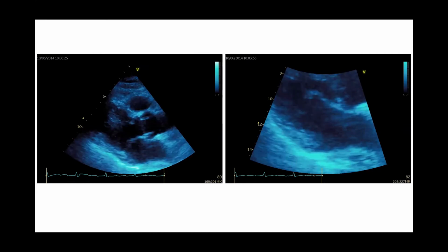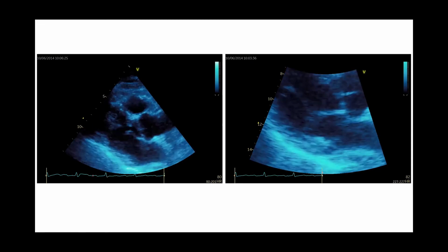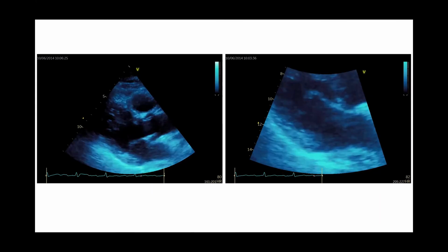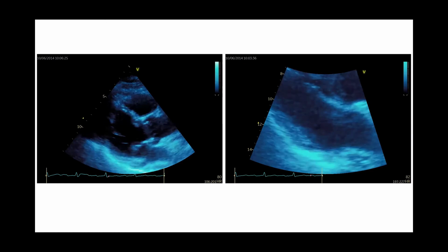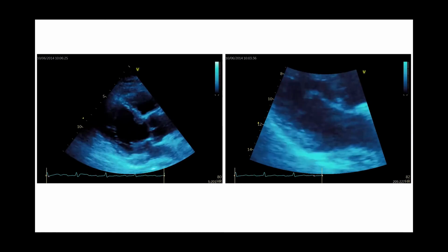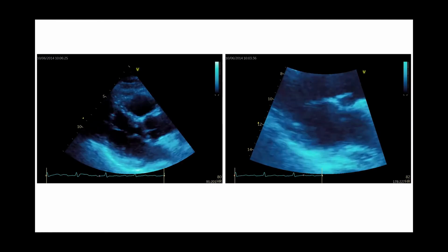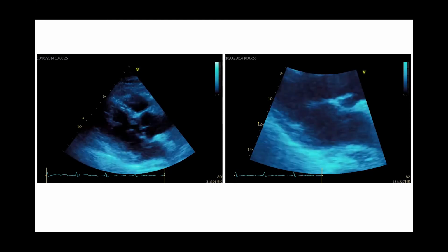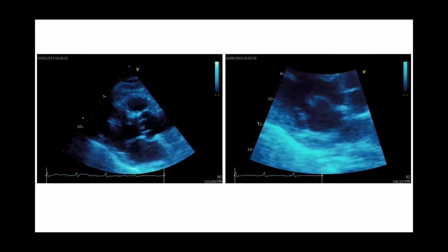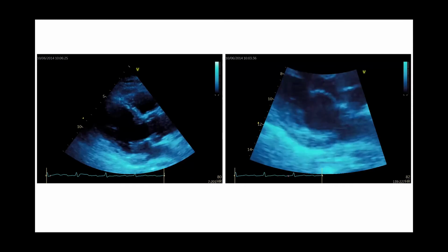Parasternal long axis with a focus view on the mitral valve on the right, and on the left, I can see that the left ventricular function looks reasonable with normal left ventricular and right ventricular outflow tract sizes, and a very thin rim of pericardial effusion. There is a bit of dilatation in the aortic root, but I would like to confirm this from a different view and take exact measurements. The left atrium looks within reasonable size.